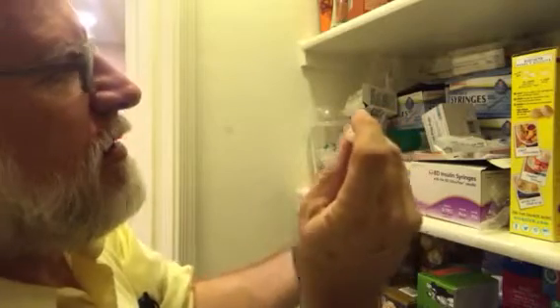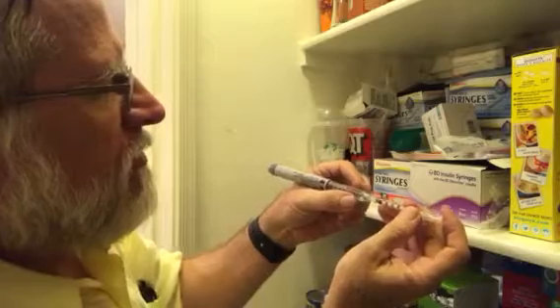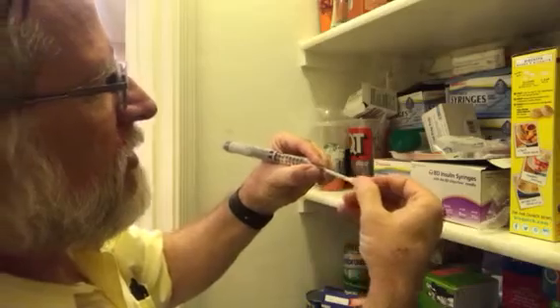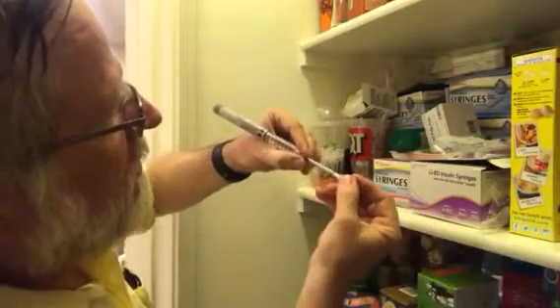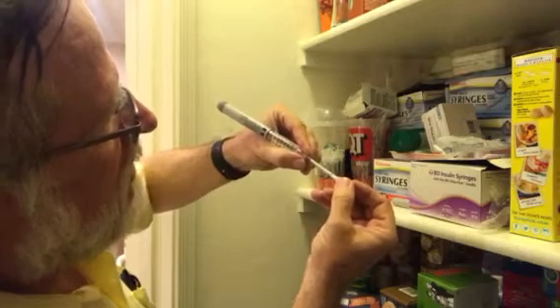Stick that in. Now we're in there. Hold this back over here and we want to get one unit. So we kind of pull that back a little bit. Make sure it's empty. Make sure we've got the fluid down here. And then pull this back just to get to the first line.